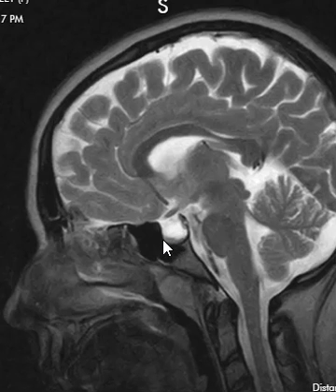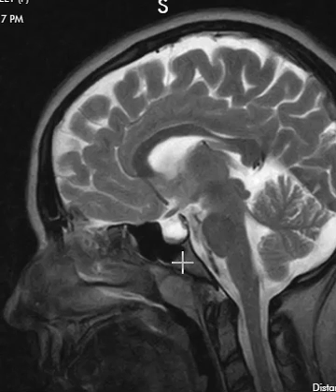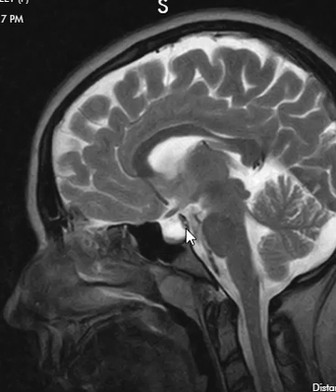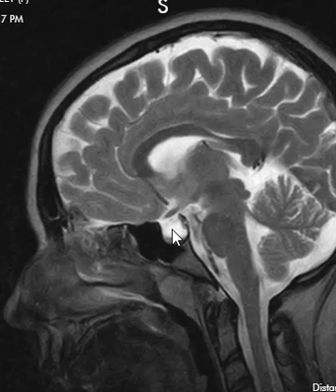The pituitary tissue is flattened along the sellar floor. In a young person like this, especially a young female, we'd expect a nice, big, plump, round pituitary. So we have elevated intracranial pressure with deficiency of the diaphragma sellae, and the fluid is pushed down and flattened the pituitary gland along the sellar floor.